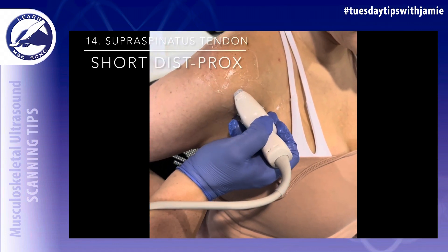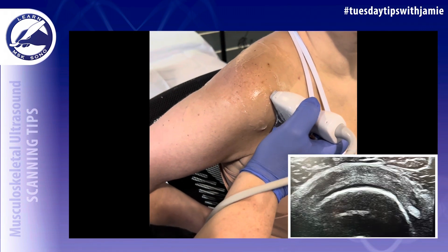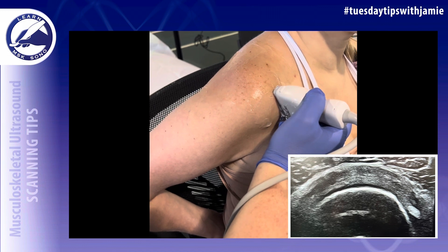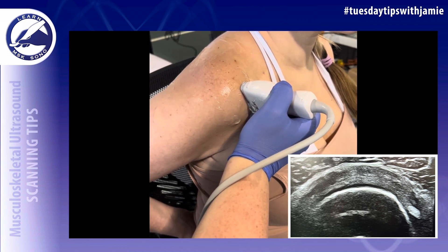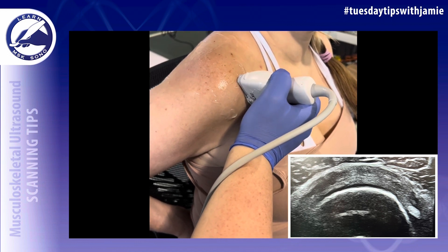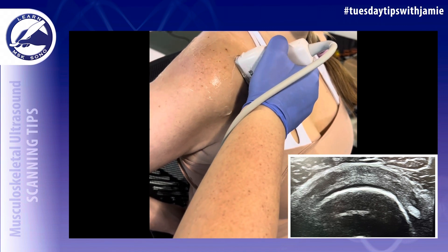Rotate the transducer 90 degrees to image the supraspinatus tendon in the short axis from distal to proximal. You'll see the long head of the biceps tendon on the anterior side of the screen. Maintain this exact angle as you scan toward the head, label the image 'supraspinatus tendon short distal to proximal,' and tilt down as you sweep up to eliminate anisotropy.